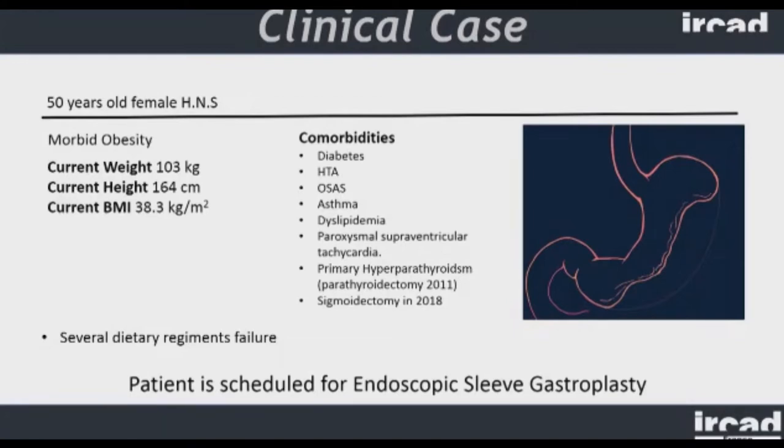She underwent several nutritional regimens, and she failed all of them. And her workup was just as any bariatric patients who are coming to our bariatric unit to undergo a surgical or endoscopic procedure. And of course, her gastroscopy was totally negative. So we're gonna go ahead and start.